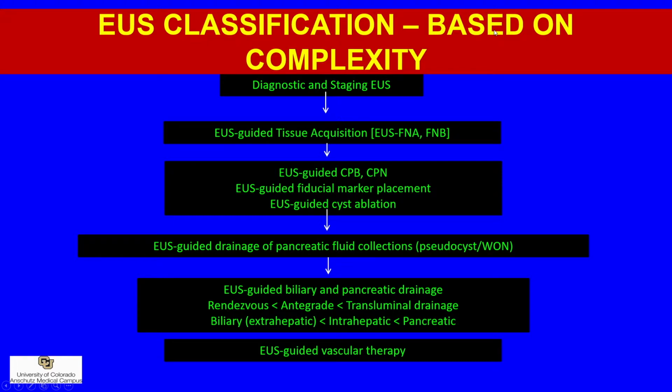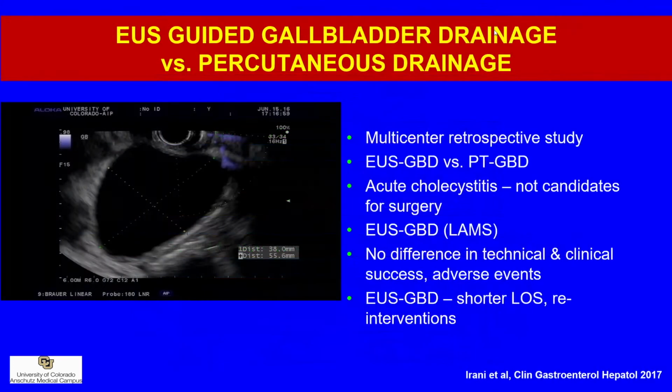I will tell you that none of our advanced endoscopy fellows actually gain competence in any of these interventional endoscopic ultrasound procedures. I'm going to talk about EUS-guided gallbladder drainage, and this really has been, again, a major change in the way we manage these really sick patients who are not candidates for undergoing a surgical cholecystectomy.